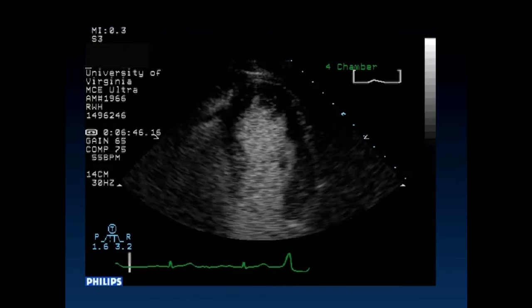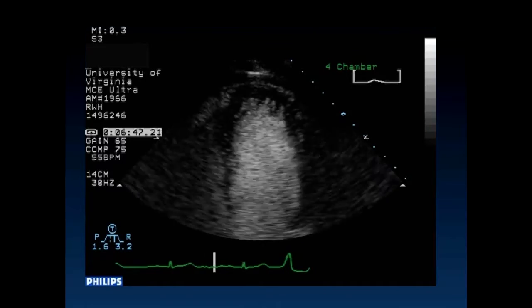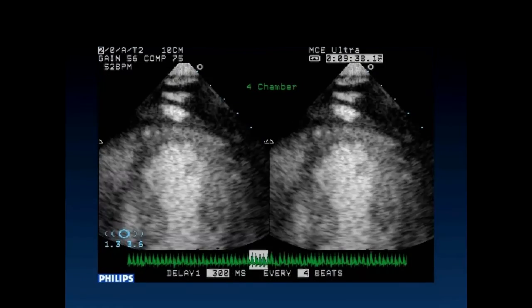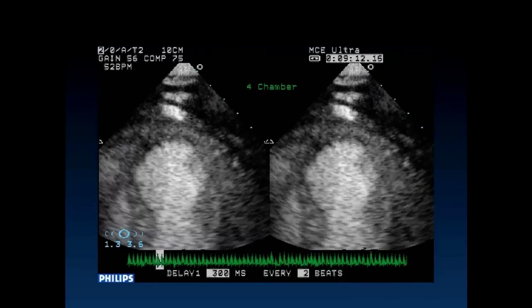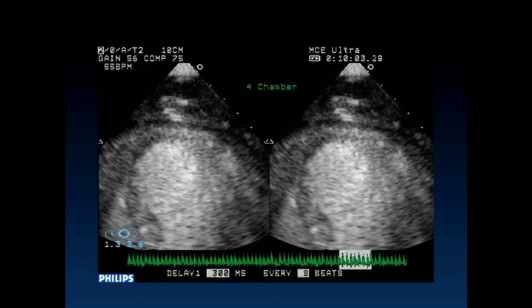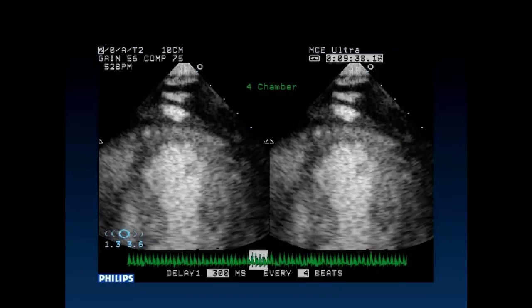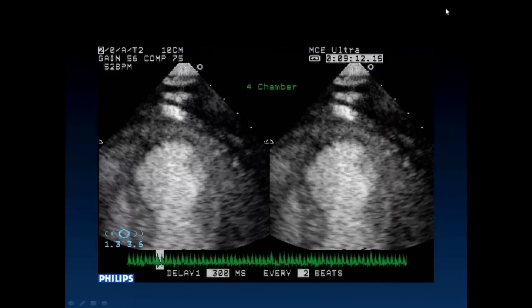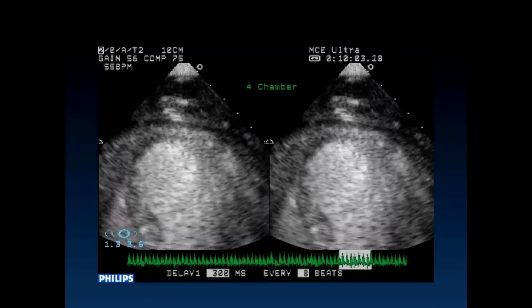that he had a significant wall thickening abnormality affecting the left anterior descending territory. The mid-to-distal, anteroseptal, and apical segments are nearly akinetic. Because of this, there was a strong suspicion that the patient's chest pain was indeed due to an acute coronary syndrome. We went further ahead and evaluated myocardial perfusion with the contrast that was already in the cavity, and you can see that in the subendocardial region of the apex, there is a perfusion abnormality which identifies that there is still slow or low flow into those segments.